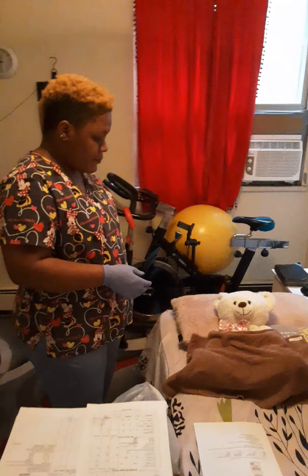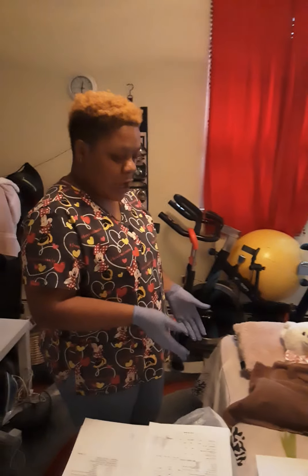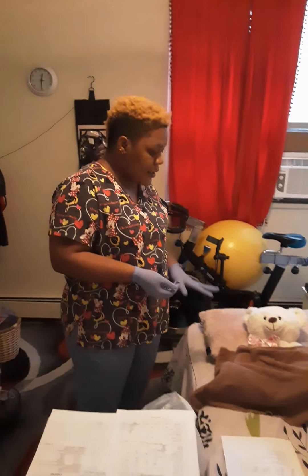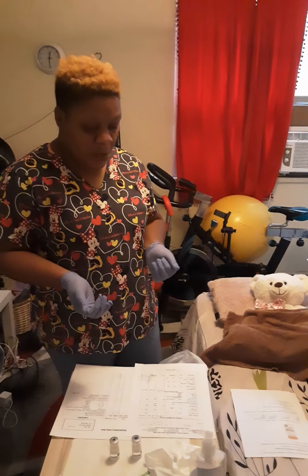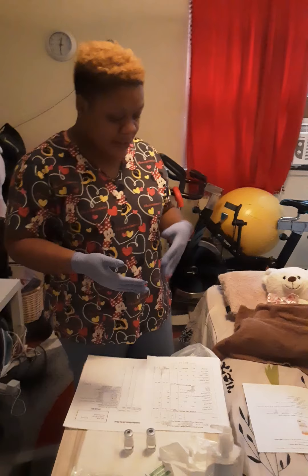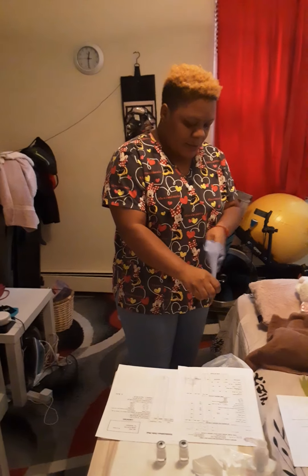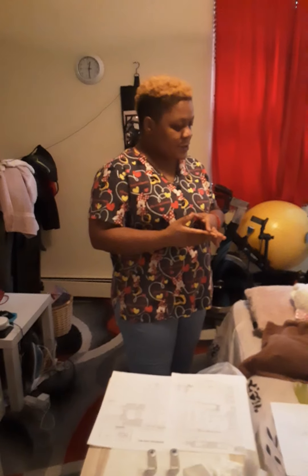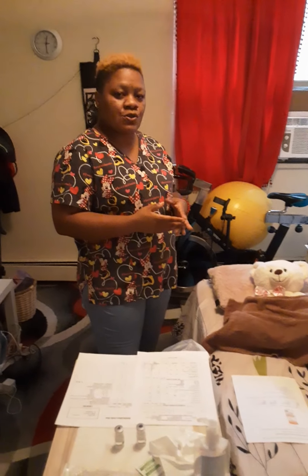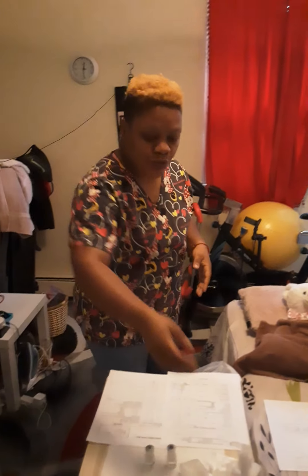Are you okay? Yes. Are you in pain? No. I will put my bed at the lowest position, put up the head rails, and make my patient comfortable. I will get rid of my needles in my sharps container and the rest of the garbage I'll put in normal garbage. I am going to remove my gloves. I am going to place the call bell as close as possible to my patient and let him know that I will be back to see him in a couple of minutes and also ensure that he calls me if he needs anything. I am going to do hand hygiene after.